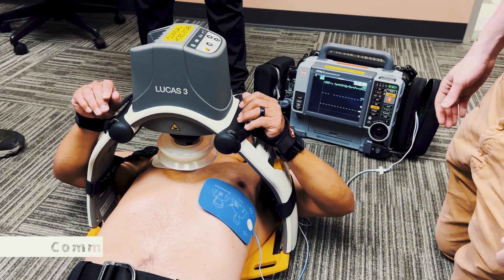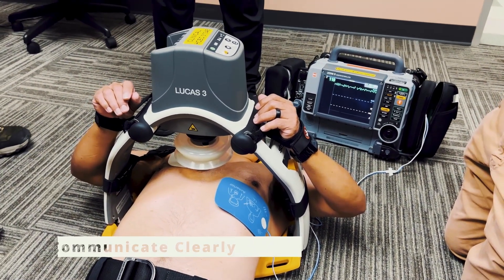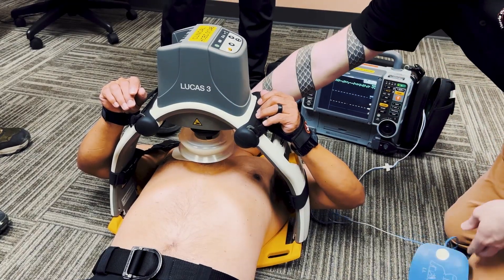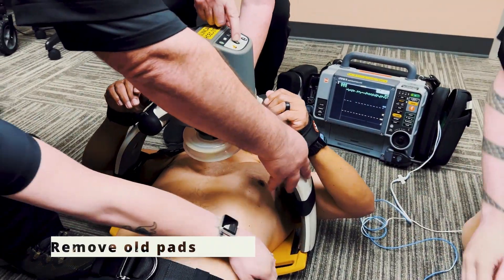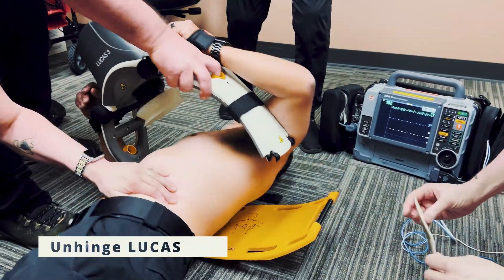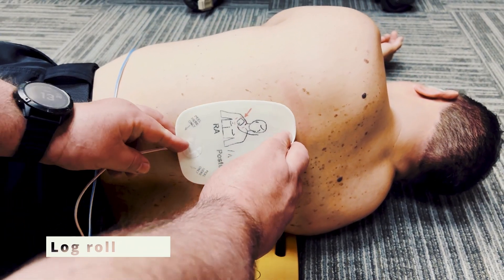To begin, communicate clearly your intention to perform a vector change. Stop compressions, remove the previously placed resuscitation pads, unhinge one side of the lucas, and log roll the patient onto their side.